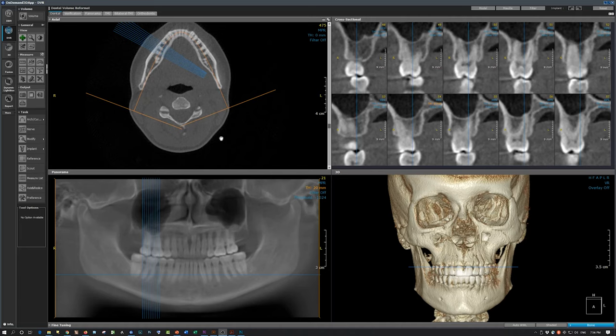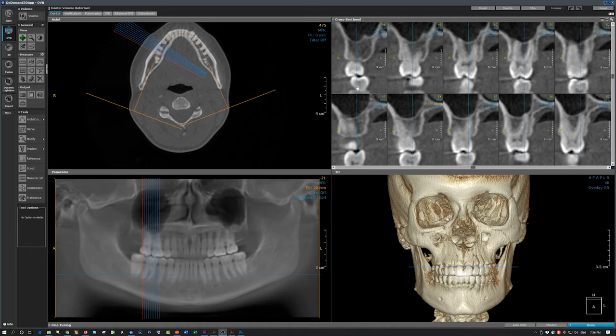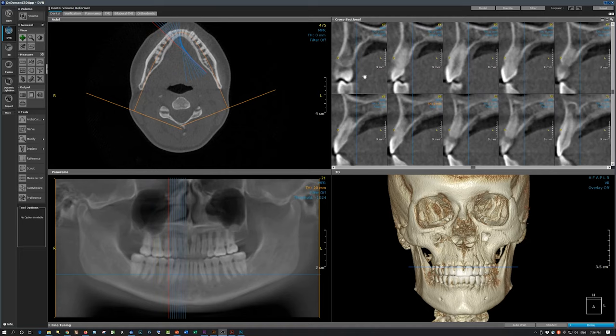Let's start with the principles of TMJ interpretation. Today I'm using on-demand 3D software. You may use any other CBCT software; most will have a similar interface. Before we start to evaluate the temporomandibular joints, it's essential that we rule out any dental pathology, and we can do this by going through the sections or slices.